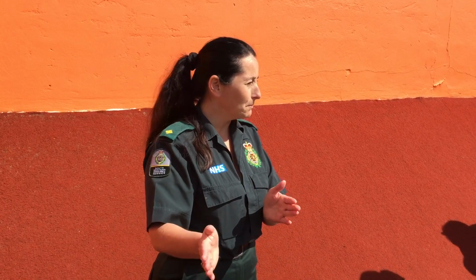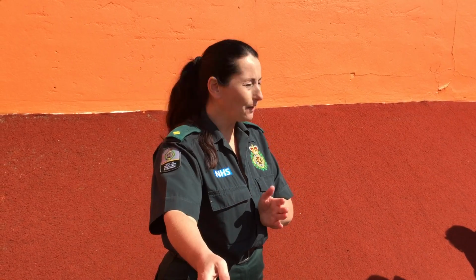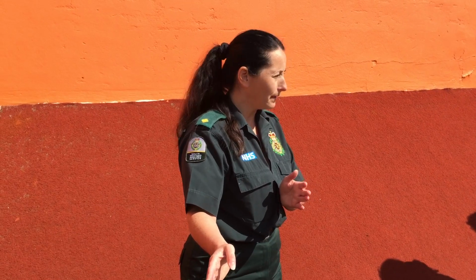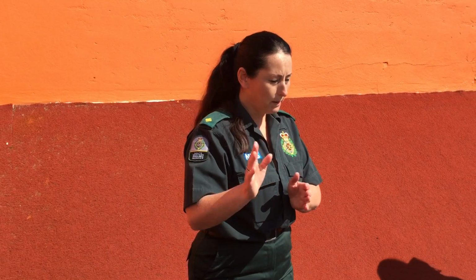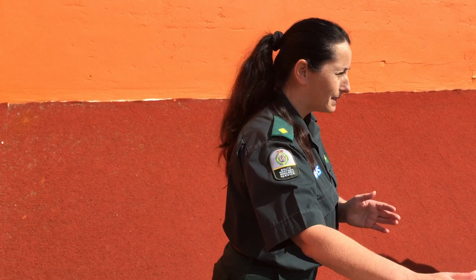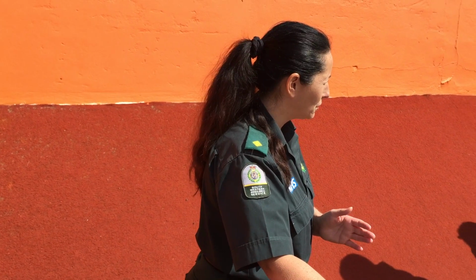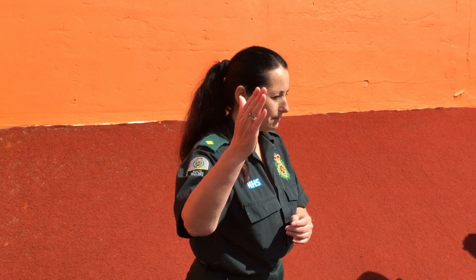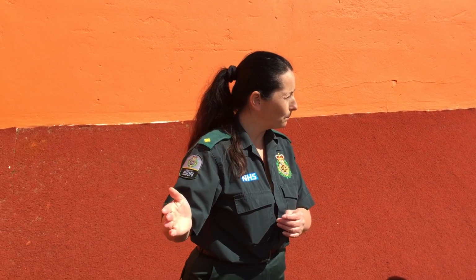Okay. The machine may say to you no shock is advised because they are not in a shockable rhythm. And that light will not light up. You can try pressing it, but it won't work. So it will say to you no shock is advised, commence CPR, so you just go on the chest. Then every 2 minutes, it just repeats this cycle.